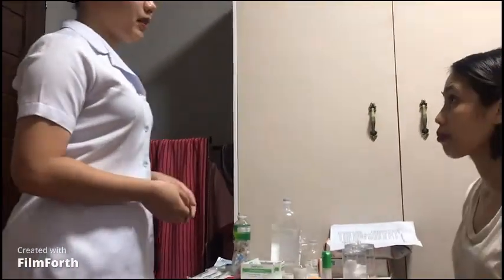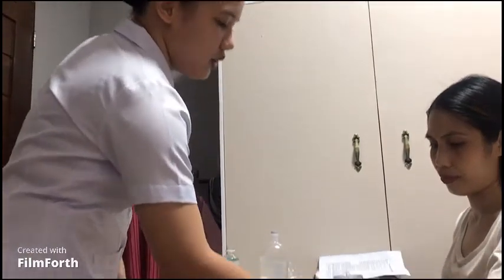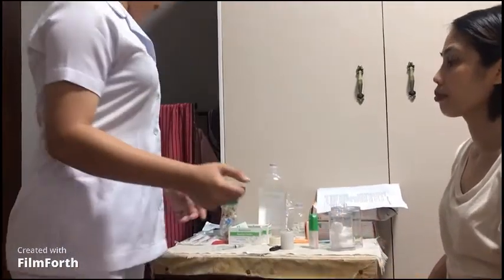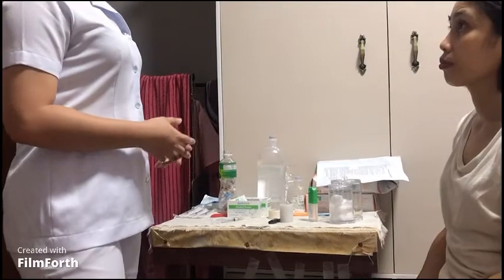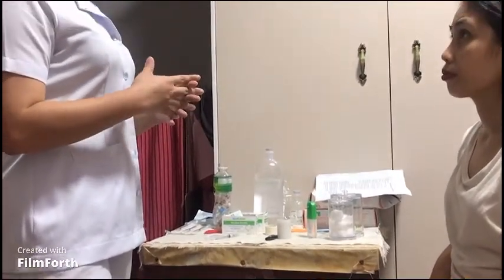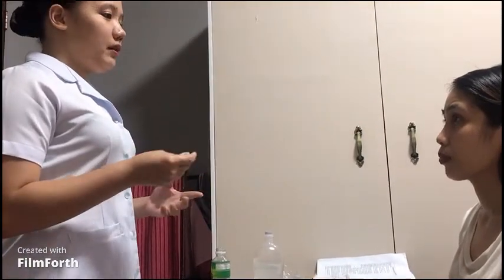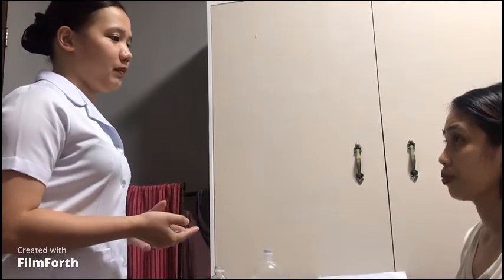Can you state your name, ma'am? So, ma'am, I will give you a medication through intramuscular injection. The purpose of this is for the fast flow of the medication in your bloodstream. So, let me provide you some privacy.